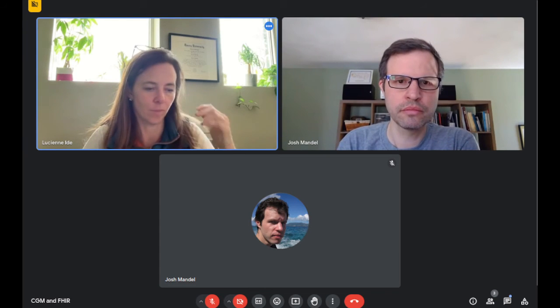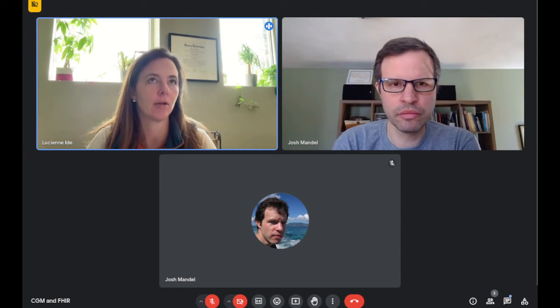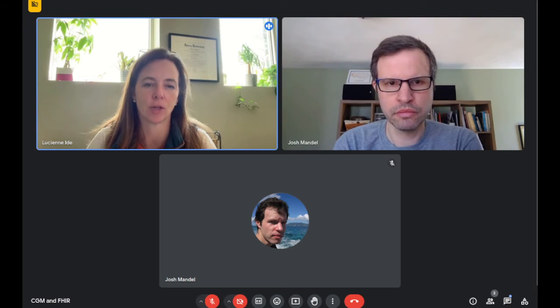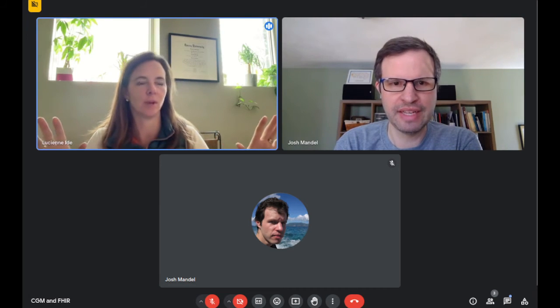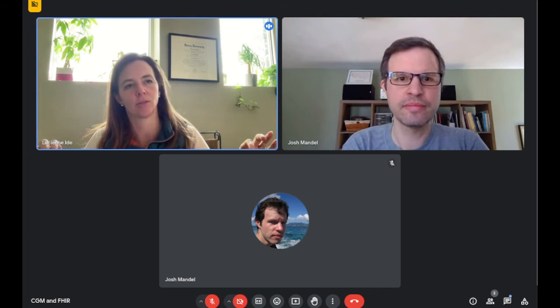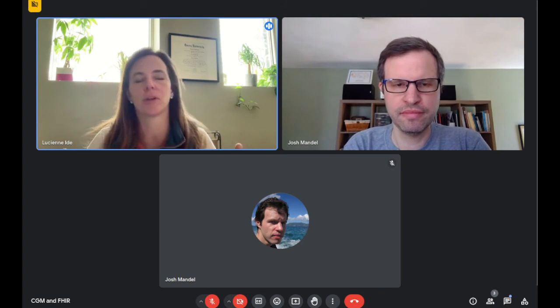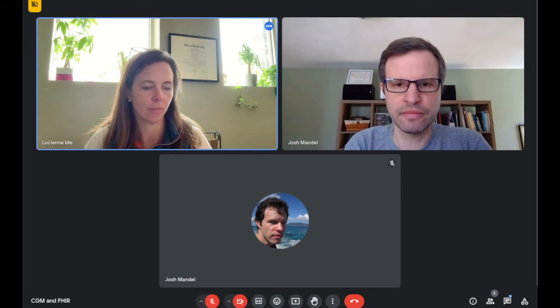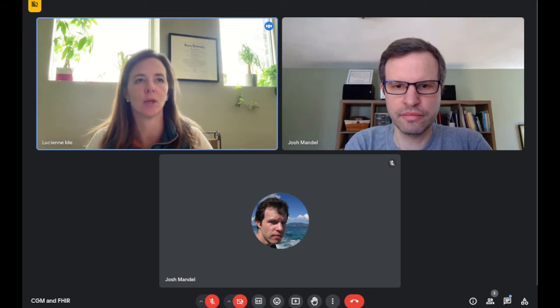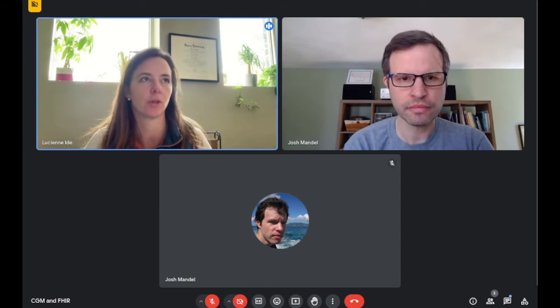My experience in talking to clinicians about it is primary care doesn't have the bandwidth for the level of granularity at which endocrinology has managed this. Primary care is a little bit more like, what's happening if I squint my eyes and look at this from 30,000 feet? Whereas endocrinology is digging into that little spiky thing yesterday. And primary care does not have the knowledge or the bandwidth to do that. So I think that model of getting an idea of what's happening with this patient, are they getting better, are they getting worse, are they having problems, with 2-week averages, is probably more than adequate to represent the overall health of the population.